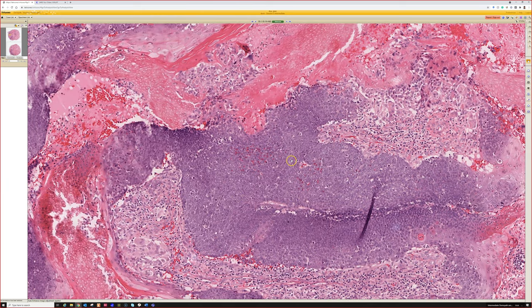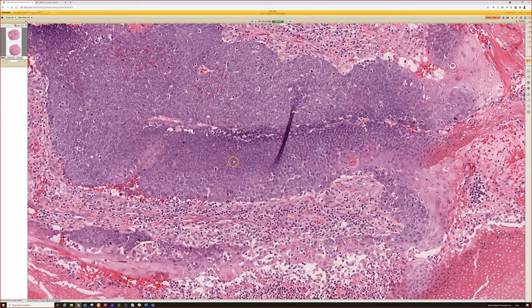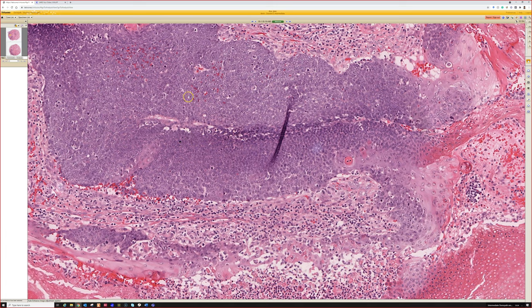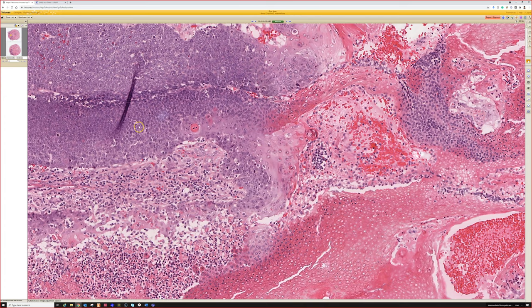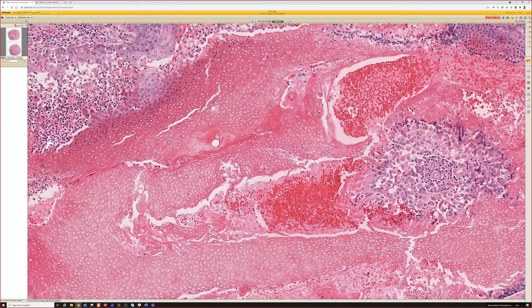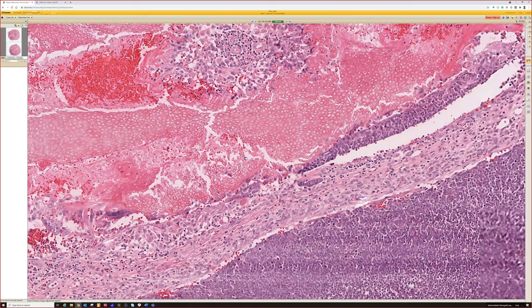Otherwise people will send these in consult because they're like, I see, you know, 20 mitoses in this field. Yeah, it happens. These are dividing cells. They're recapitulating the germinative matrix of the hair follicle, whose job is to grow and reproduce and divide and form a hair shaft, right? Instead of forming a hair shaft, this tumor makes these sheets of ghost cells. So it's trying to make hair, but instead it makes these sheets of ghost or shadow cells.